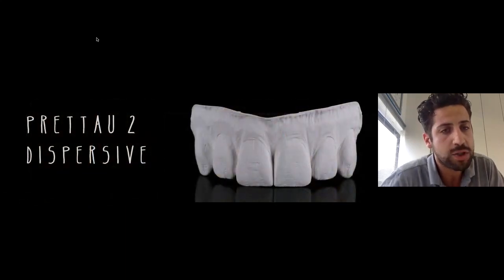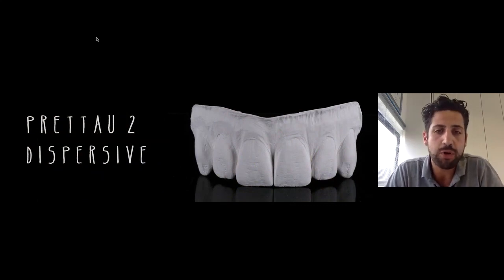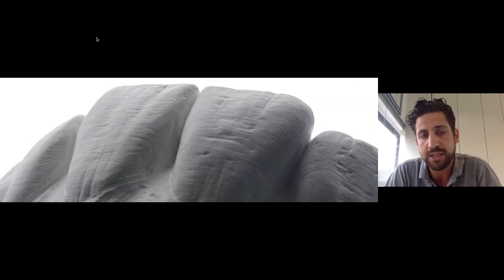But let's see also the Prettau 2 Dispersive with the gingiva. So I made the protocol for how to layer the gingiva on Prettau 2 Dispersive. As you can see, we made a really nice texture of the surface. I really like to put the white light behind the structure to see the contrast with the surface.